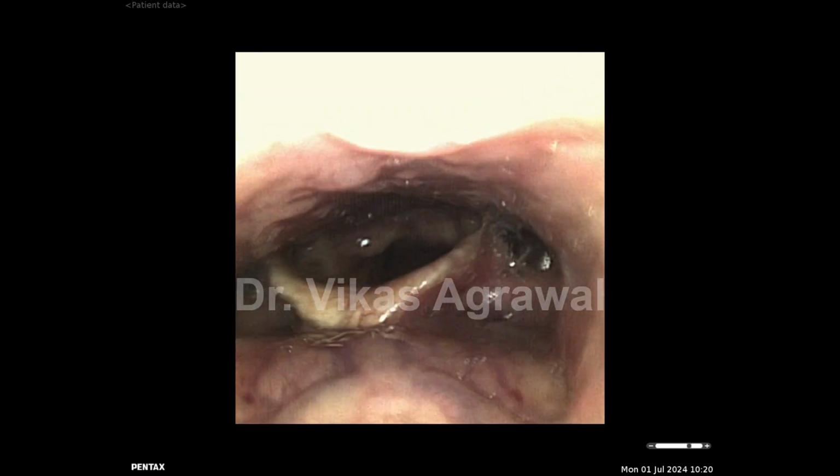Right? This is a soft palate collapse. Now his saturation is going to 85. His BIS is in the 70s, which is absolutely the correct range. So at this stage, we are first performing the nose surgery. And as I said, he'll be able to use his CPAP more effectively.